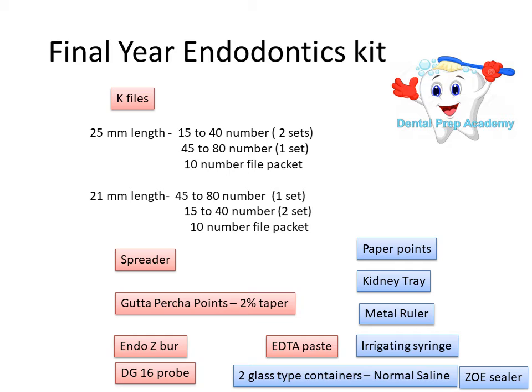But some people fear that the sodium hypochlorite might go into the periradicular area and may lead to a hypochlorite accident. So sometimes people dilute it and use it in concentrations of about 3%. So it's up to you.